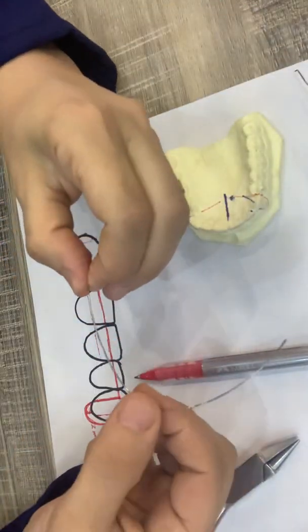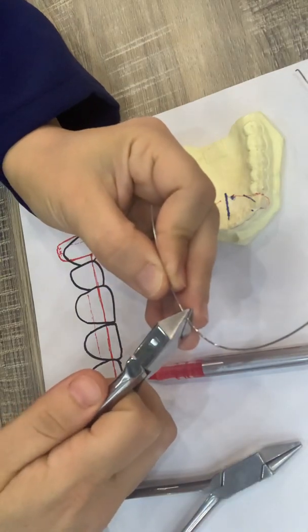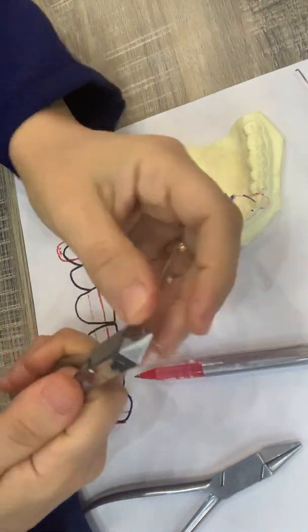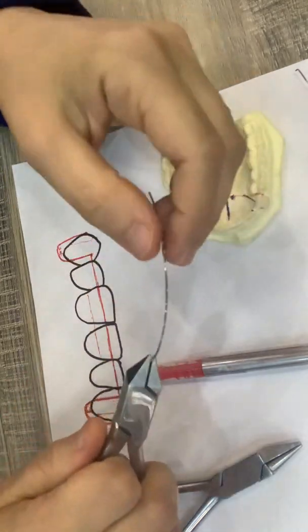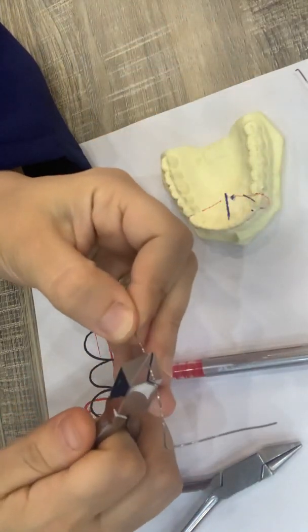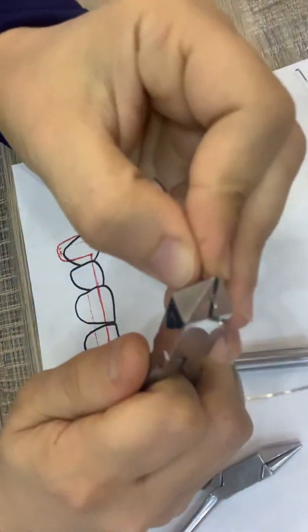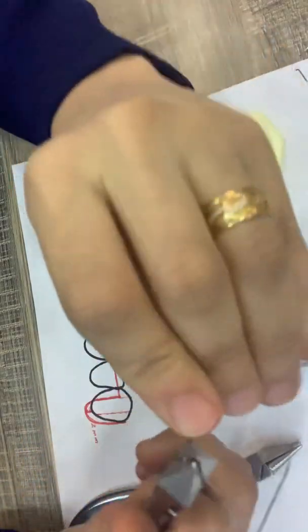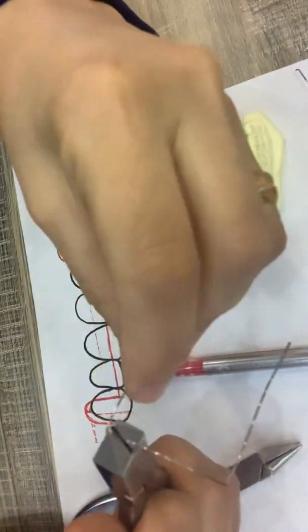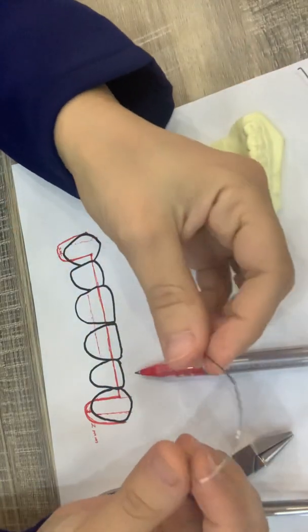Now we make the U-loop by making a right angle bend, and the other side also.